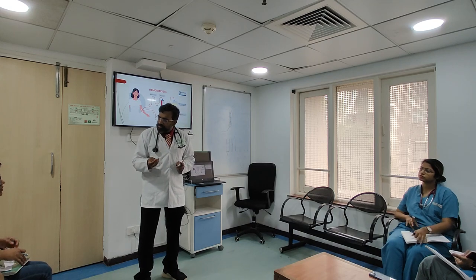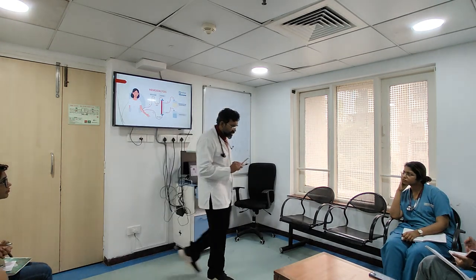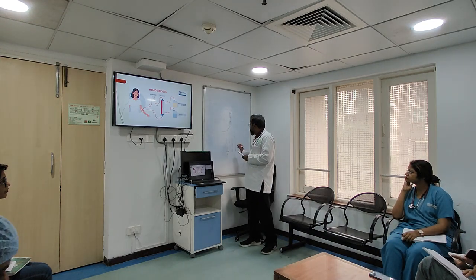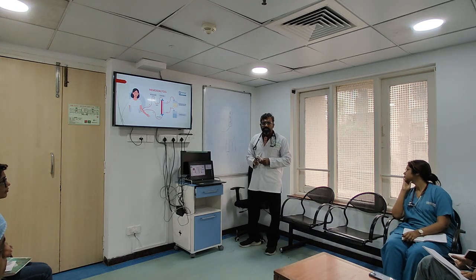Similarly, when we are using CRRT, we don't give 0K. If you give 0K, the potassium will become very, very low, and the patient will have hypokalemia-related arrhythmia and probably arrest also. Are you understanding? So I will give a small amount of potassium in that. Classically, these dialysates will have a very small amount of potassium.